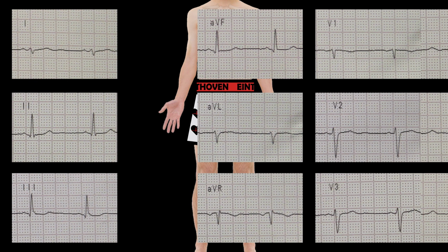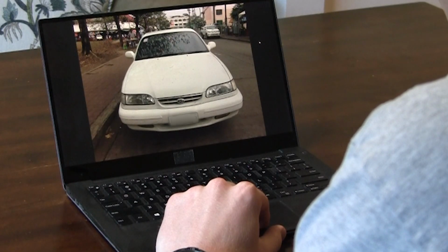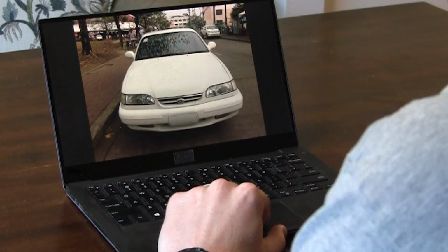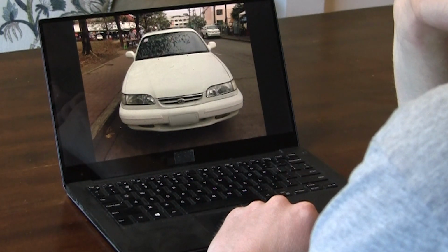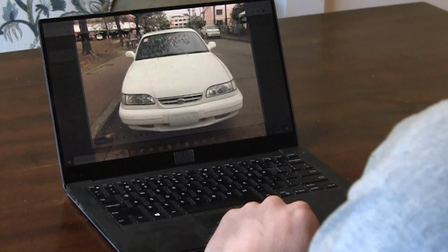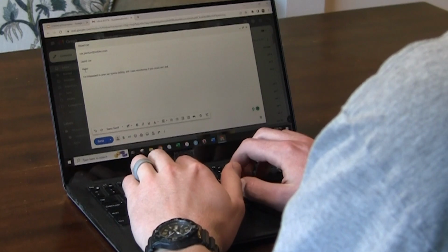Okay, at this point, you might be wondering why we have so many leads. Why would we ever want so many different EKG graphs? Think about it this way. Imagine you want to buy a used car online. Because you're not there to physically inspect the car yourself, you have to rely on pictures. But what if the seller only gave you one picture of the car? The car looks fine in this picture, but you can't see the entire vehicle. If you're a cautious buyer, you might ask for more pictures from other angles.